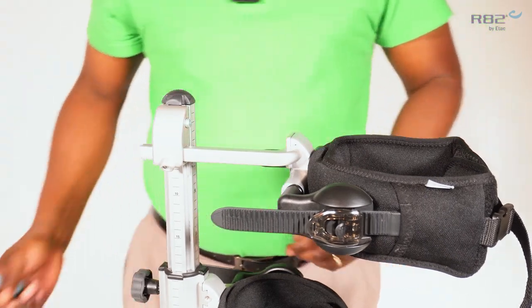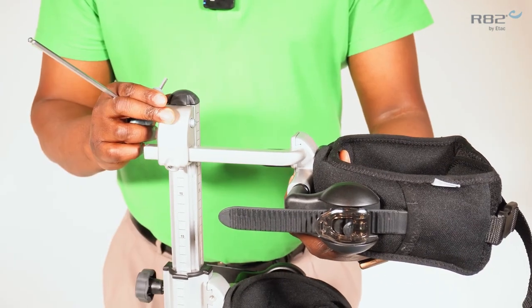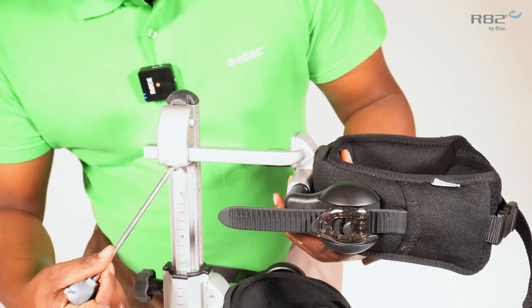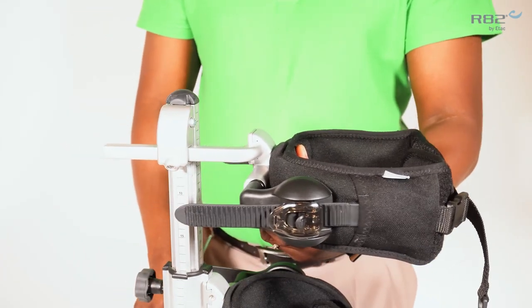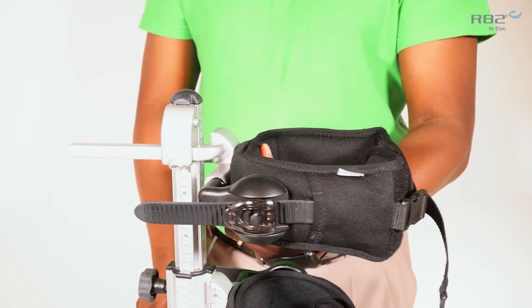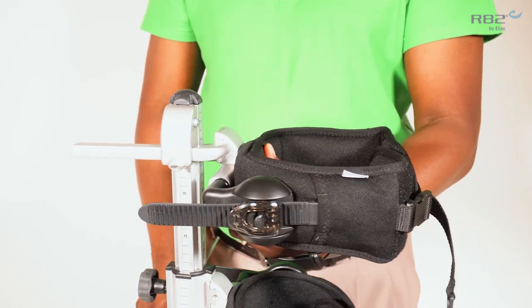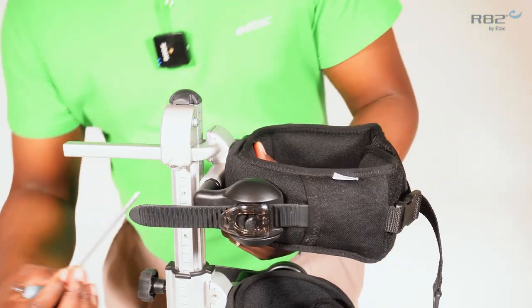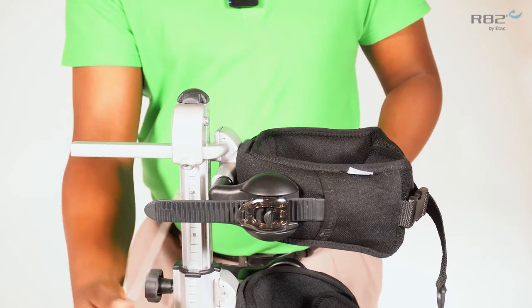Once the displacement kit is in place and the trunk support is mounted firmly onto the displacement kit, you can adjust the depth of the trunk support to assist a user with proper body alignment. The displacement kit is also height adjustable.